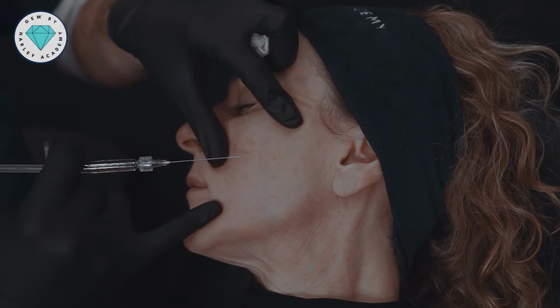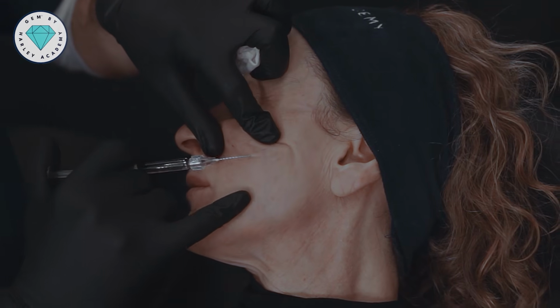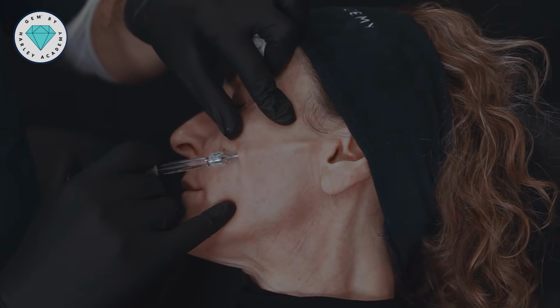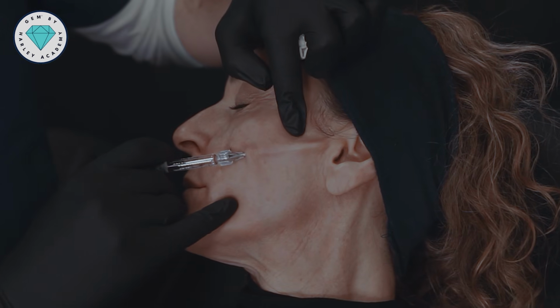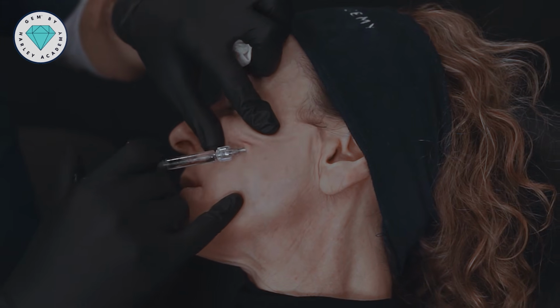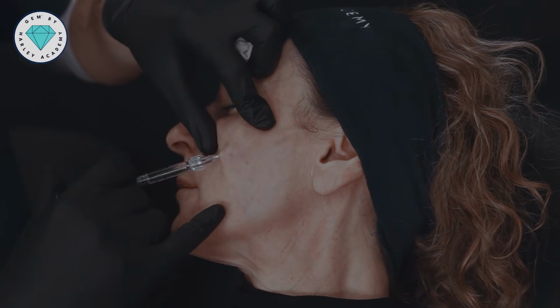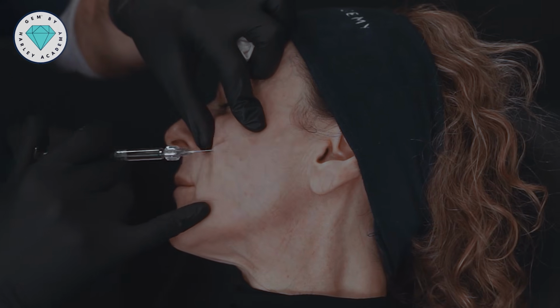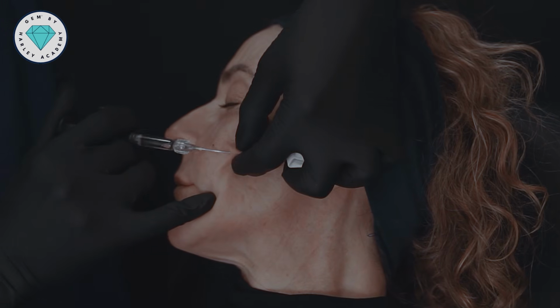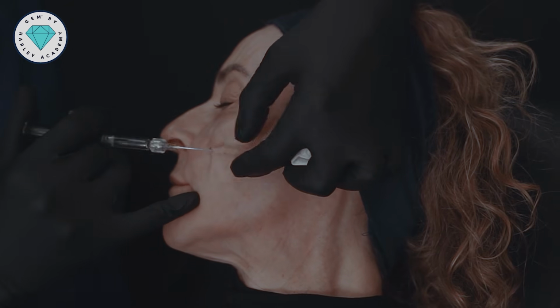Thanks, Max. So we've got some cannula tricks and tips. Do you want to talk us through some of these, Max, in this part of the face? So in this part of the face, staying superficial is key. One of the easiest things to do is to not be able to see and feel your cannula and dip down. And what's beneath this layer is our parotid gland. And ideally, we don't want to be adding filler into that. So if you can't clearly see the outline of your cannula, come back towards your entry point, you don't have to come all the way out, finding your plane again, and then staying nice and superficial.